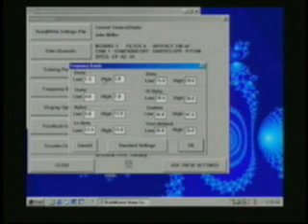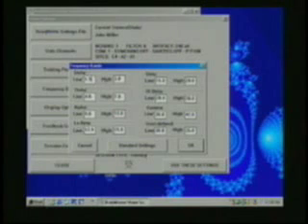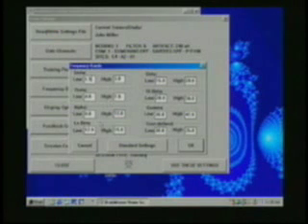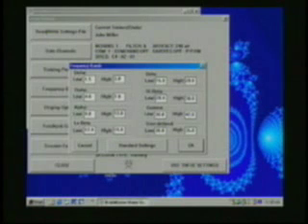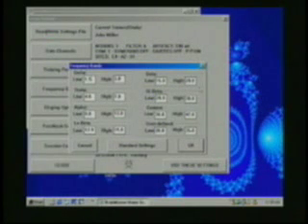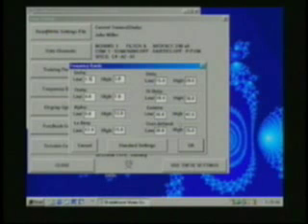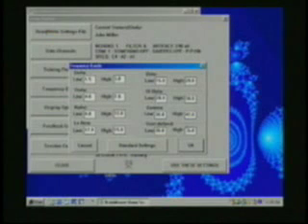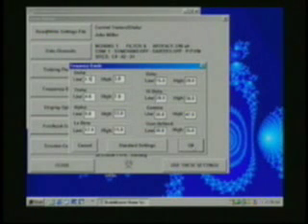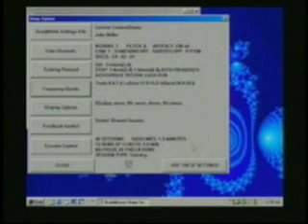The standard frequencies are 1 to 3, theta is 4 to 7, alpha is 8 to 12. Low beta is 12 to 15, used for SMR. Beta is 15 to 20. High beta is 20 to 30. The gamma is 38 to 42. And the user defined band is set at 30 to 35 just as a convenient starting point. So we'll use these settings.